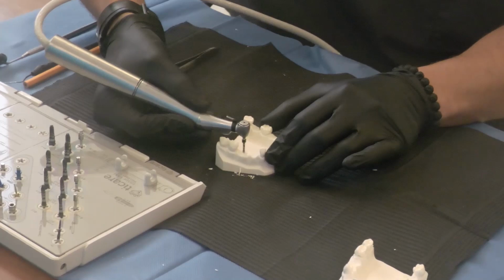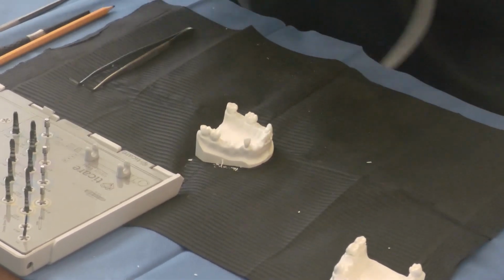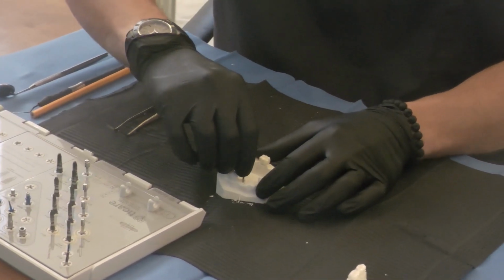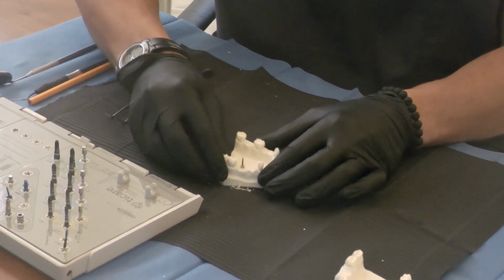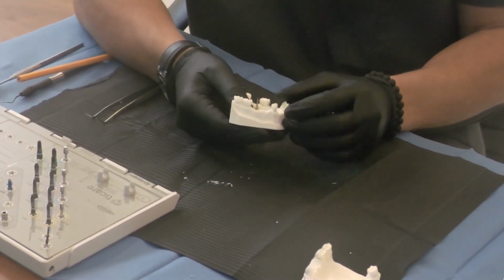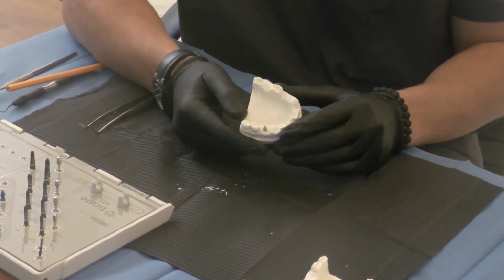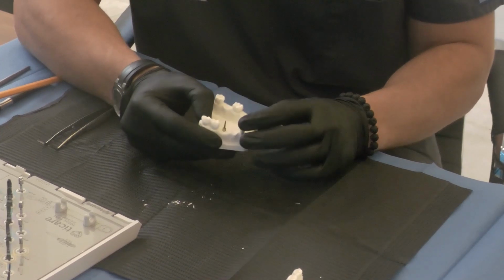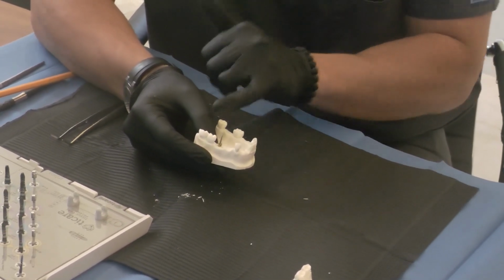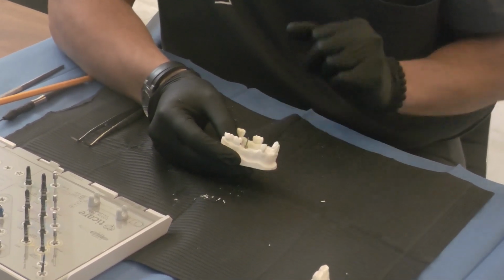At this stage, you can also use a pin in order to check the parallelism and verify that the position is ideal on a three-dimensional basis. Here you can see that it follows the parallel alignment of the adjacent molars, and also check it from the occlusal point. It will be coming out from the cingulum if we place in the anterior area, and from the mid aspect of the molar, considering that we're going to be replacing a molar here.